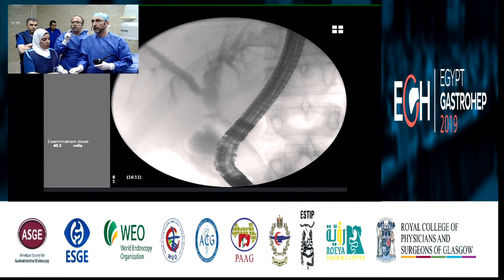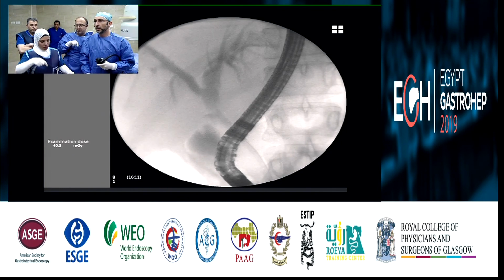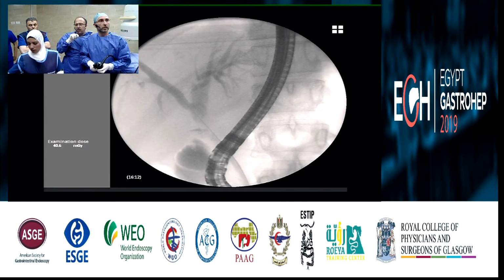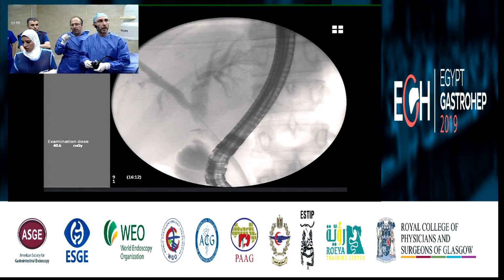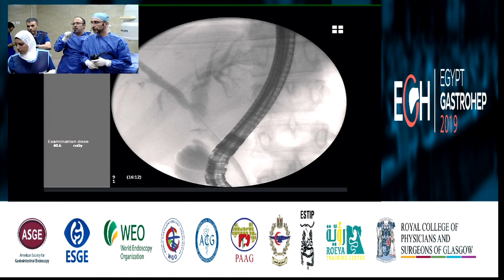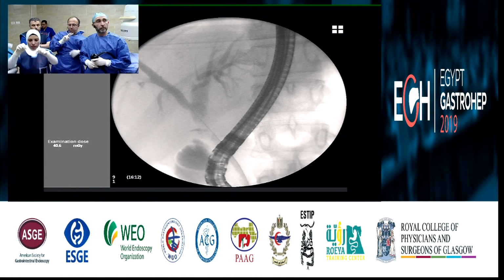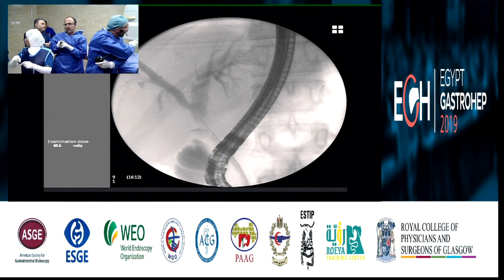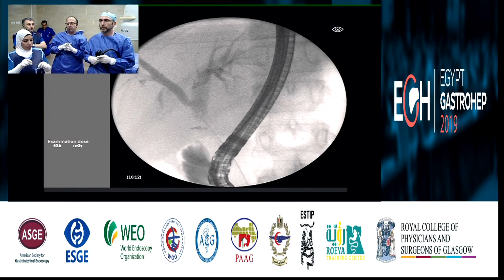No, the reason we start with the right side here is that the left side is more dilated, and because we're planning asymmetrical stents, one plastic 8.5 and one 10 millimeter fully covered metal, the plastic goes into the thinner duct, which in this case happens to be the right side. So we first put the plastic, because when you place plastic and metal side by side, you cannot place the metal first and then the plastic.